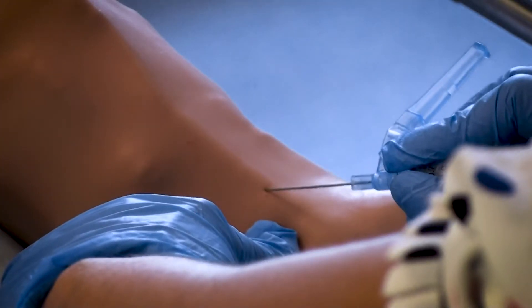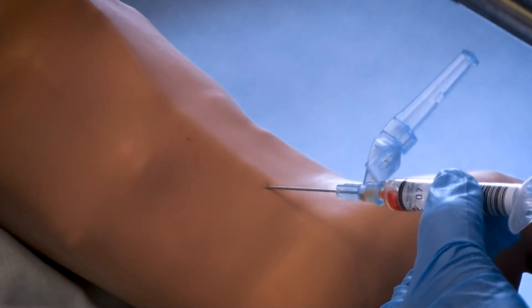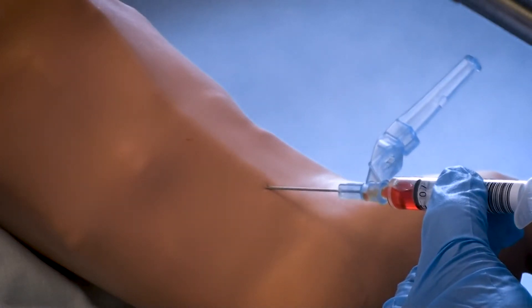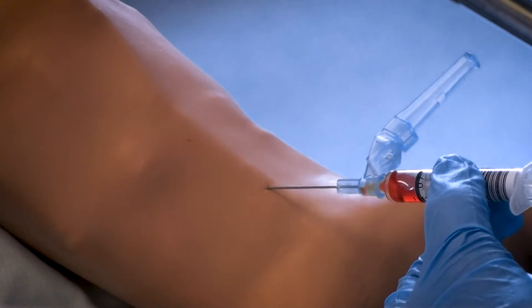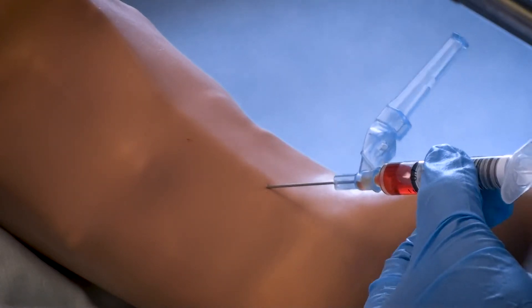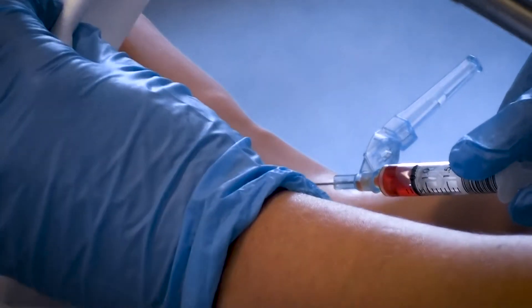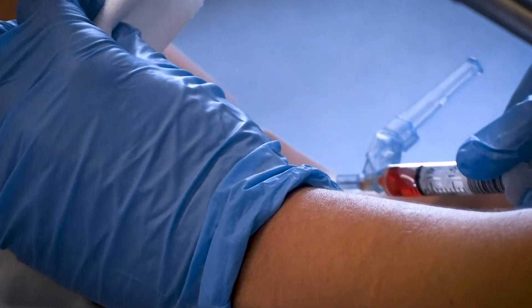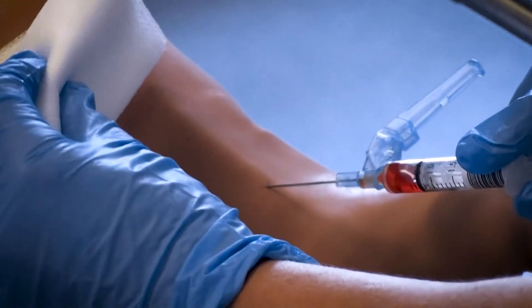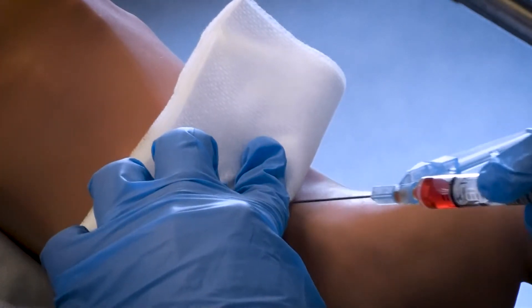Insert the needle at 30 to 40 degrees at the point of maximum palpation and advance it slowly until arterial blood flushes back into the syringe. The syringe should then fill under arterial pressure and may need initial gentle aspiration. Once you have obtained at least 0.7 mils of sample, withdraw the needle smoothly whilst applying a gauze swab with the non-dominant hand.